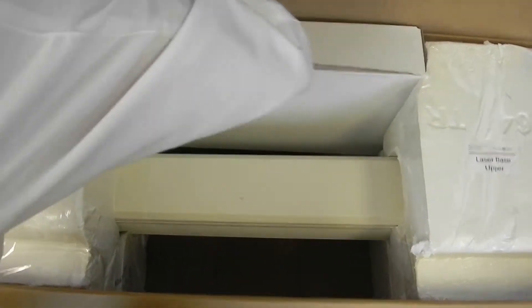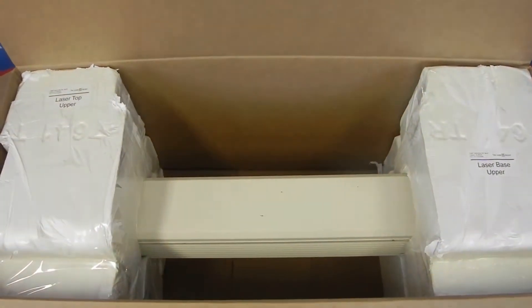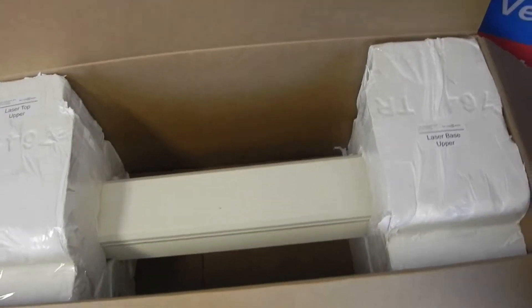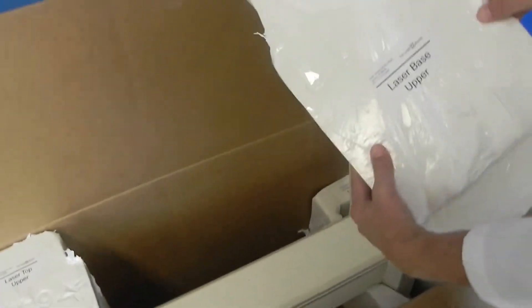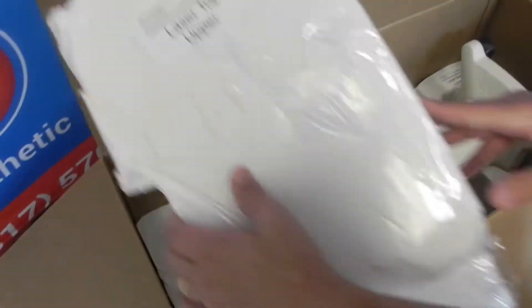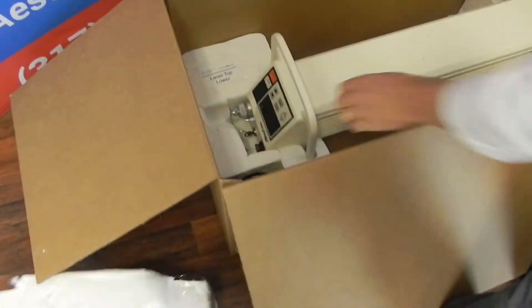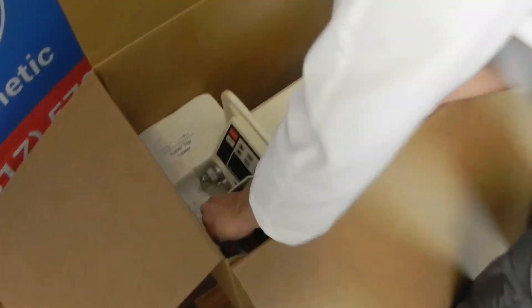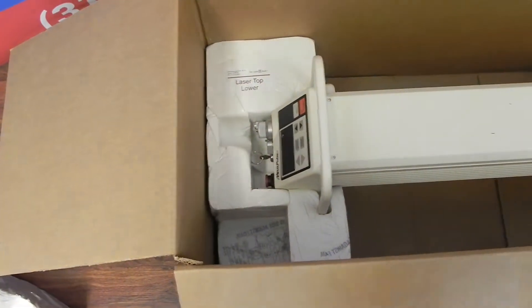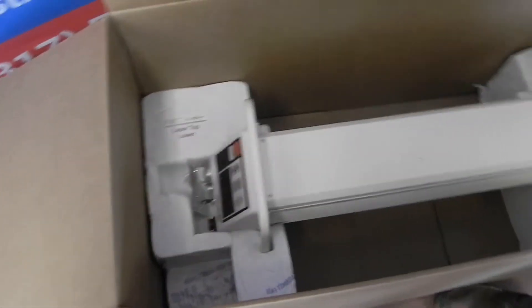Remove your accessory box and set that aside. Go ahead and take the laser base upper piece off — the laser top upper piece off. The foot pedal is in the little compartment right there, so take the foot pedal out and set it on the floor. Then you can just lift your laser out of the box and stand it up.